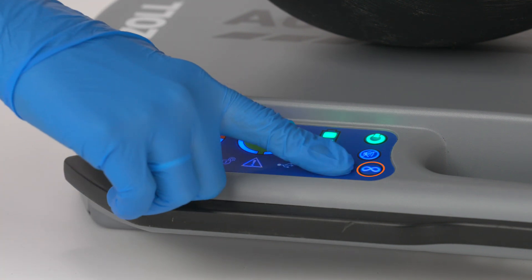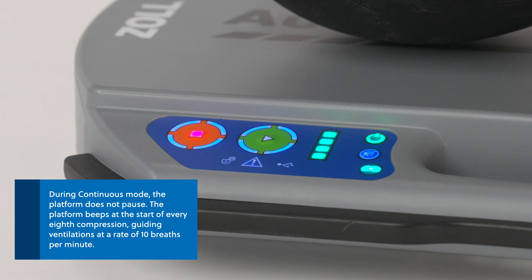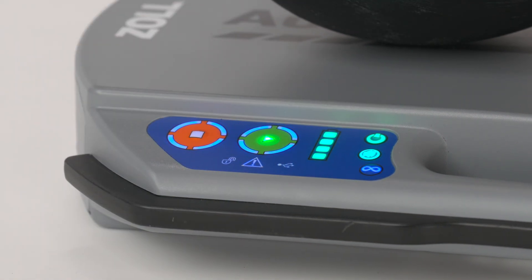When 30 to 2 mode is selected, the platform will beep at compressions 28, 29, and 30 to alert users to pause for 3 seconds to deliver 2 ventilations. During continuous mode, the platform does not pause. The platform beeps at the start of every 8th compression, guiding ventilations at a rate of 10 breaths per minute. The mute button illuminates green when activated.